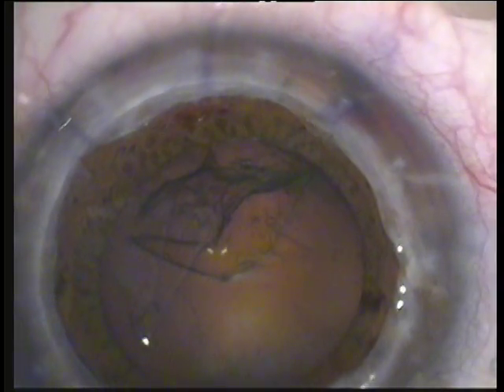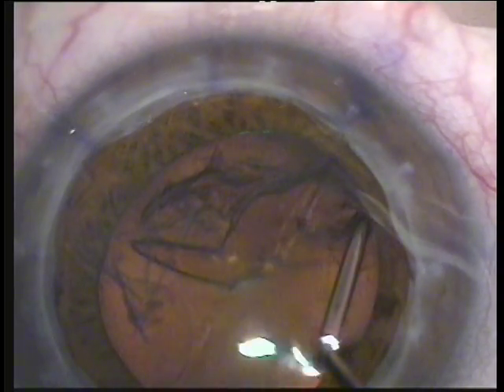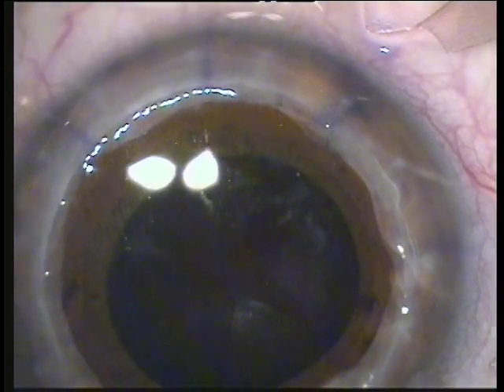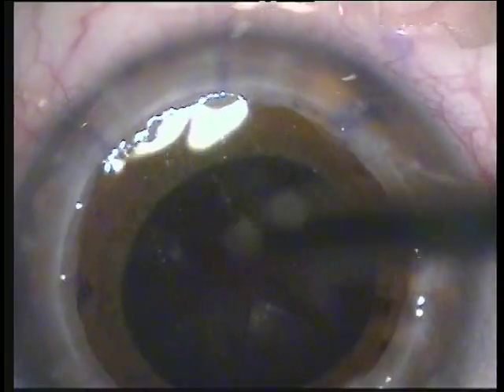We'll go on with the usual steps of hydrodissection and hydrodelineation, which will basically deliver the lens. As you can see here, the lens pops out of the capsule bag and will be delivered with the irrigation cannula. The irrigation-aspiration will follow to remove as much cortical material as possible.